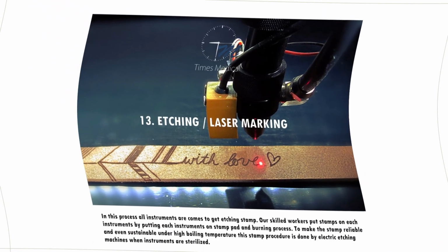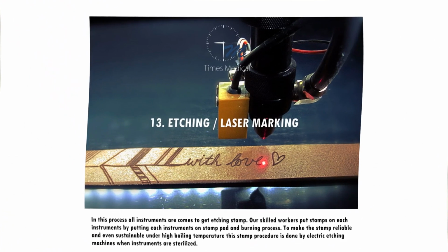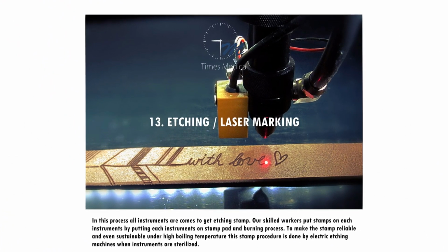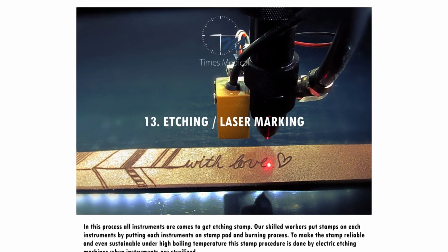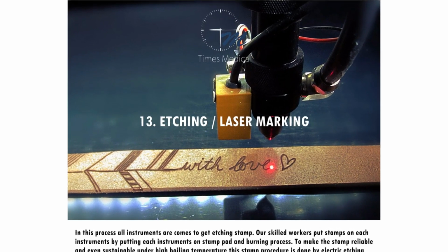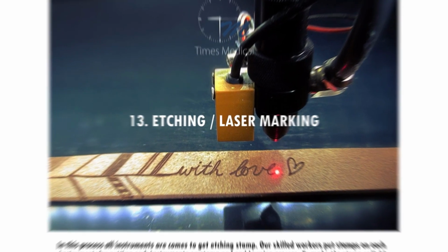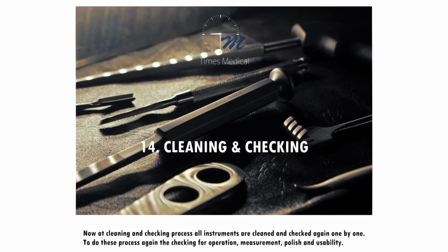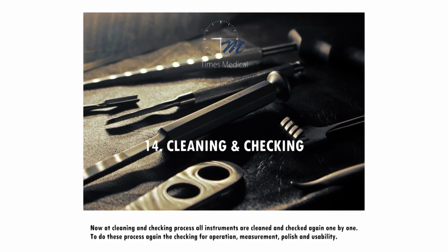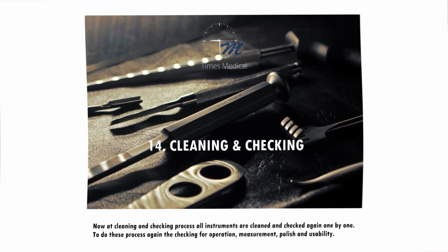Instruments come to get etching and laser marking stamp, to make the stamp reliable and even sustainable under high boiling temperature. This stamp procedure is done by electric etching machines when instruments are sterilized. All instruments are cleaned and checked again one by one. To do these processes again, the checking is for operation, measurement, polish and usability.